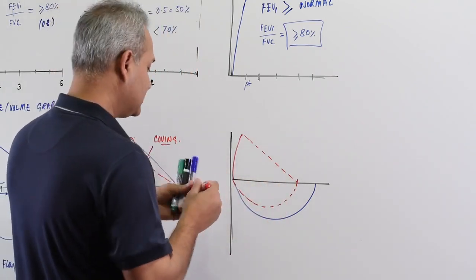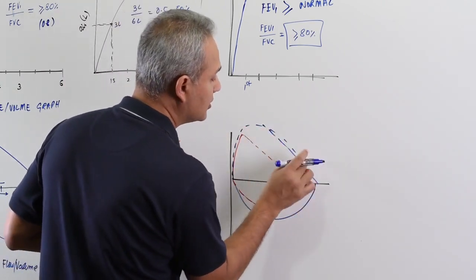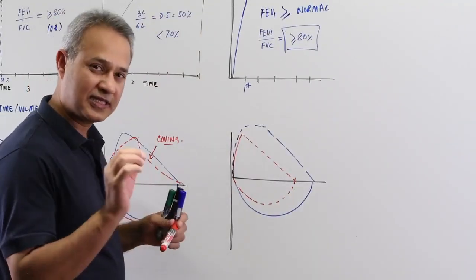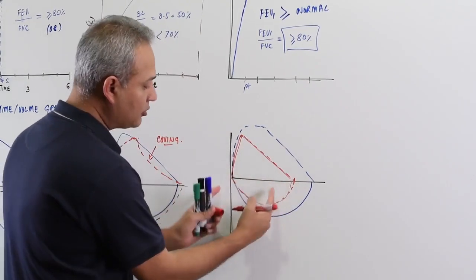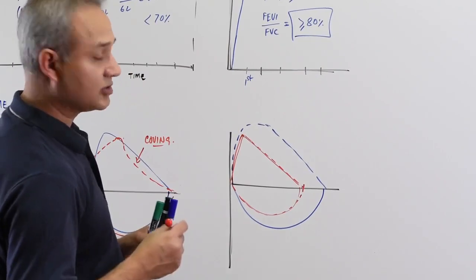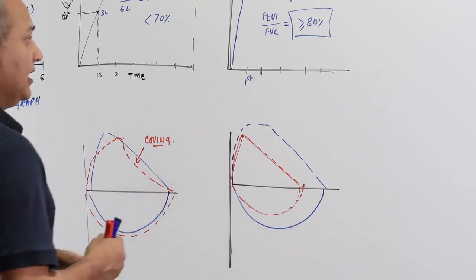So the whole system has smaller lung volumes. Here, I'm going to exaggerate the graph a little bit. If you see straight lines and a narrower graph, you can look at it and say, this person looks like he may have a restrictive disease. So this is the quality of the restrictive disease.